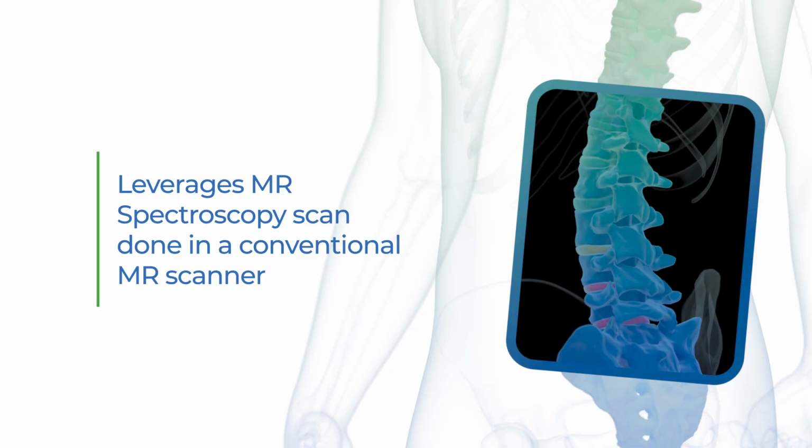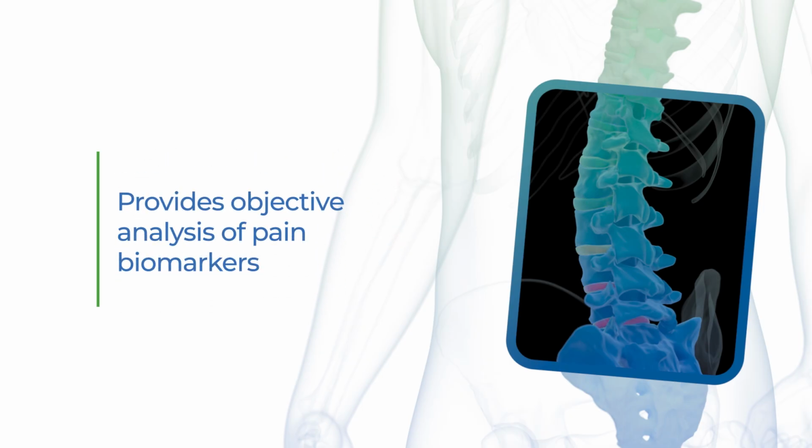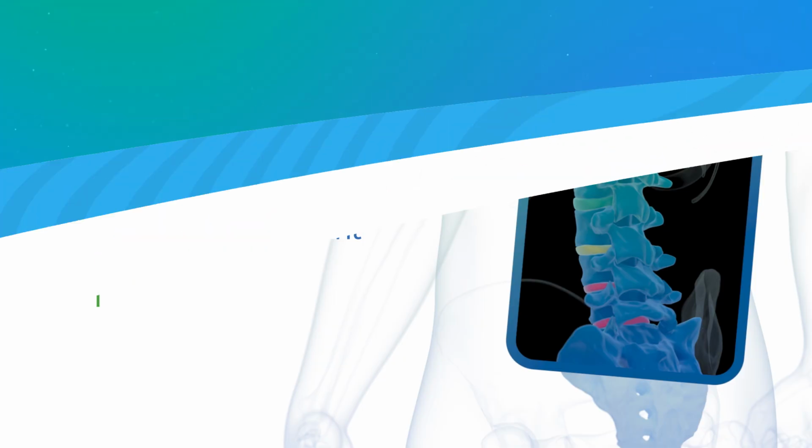The MR spectroscopy scan used by Nociscan can be performed in a conventional MR scanner. Nociscan provides an objective analysis of pain biomarkers individualized to each patient. In conjunction with other diagnostic tools, Nociscan delivers critical insights into the source of a patient's low back pain to help physicians optimize treatment plans.